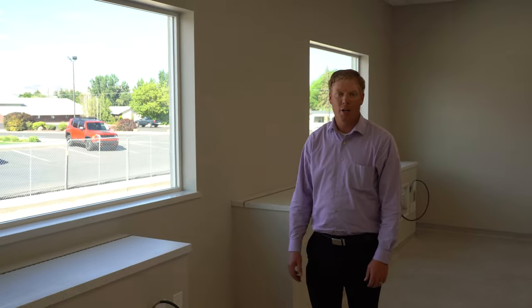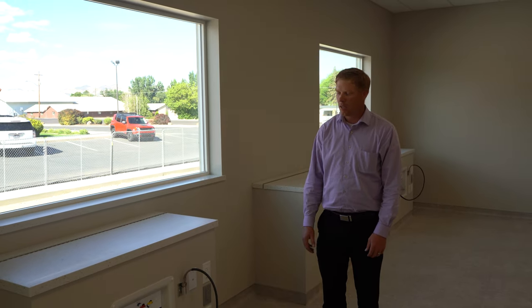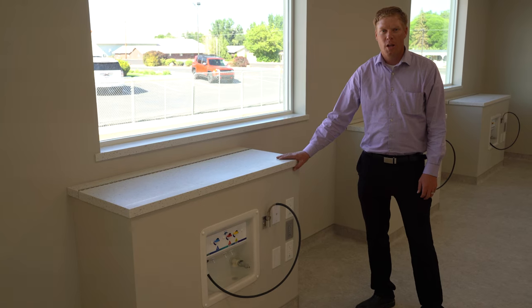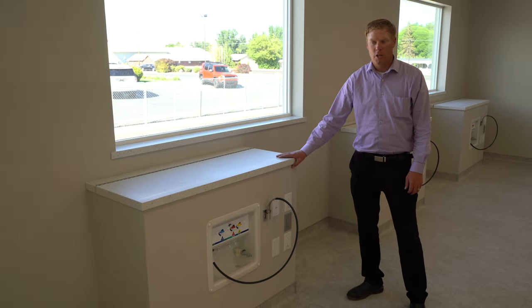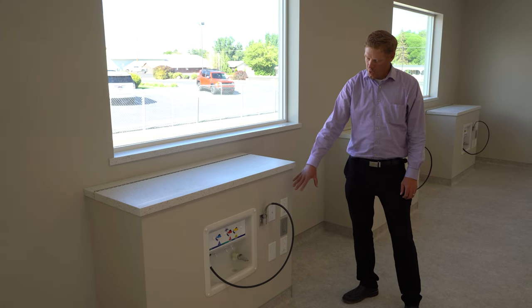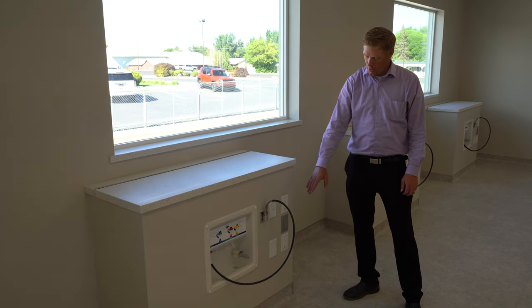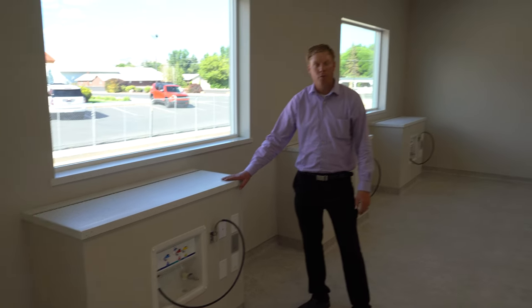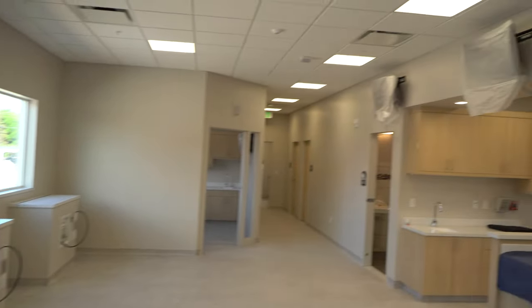This is where patients will receive their dialysis. Each one of these is a station — we'll have a total of 12 stations here to treat the patients. Each station has all the connections they need, headphones for the patients, and TVs up above for them to watch.